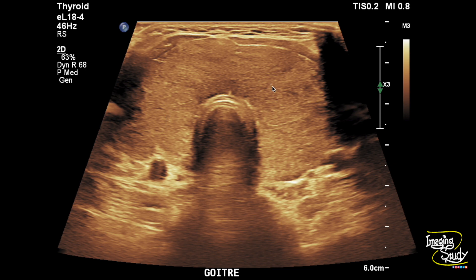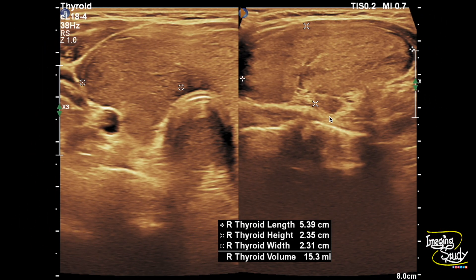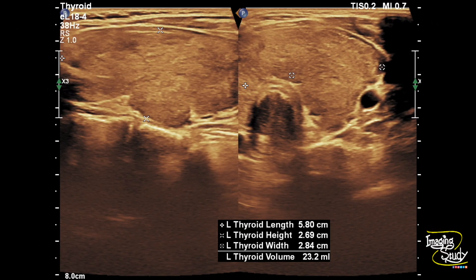Here you can see the transverse section of the thyroid gland. This is the right lobe, this is the left one, connected to each other by an isthmus. You can see the thyroid gland is diffusely enlarged and the parenchyma looks quite heterogeneous. Here's the lobe measurement — the right lobe is quite enlarged and heterogeneous. The left lobe is also enlarged and heterogeneous, so it is a diffuse enlargement with heterogeneous echotexture.